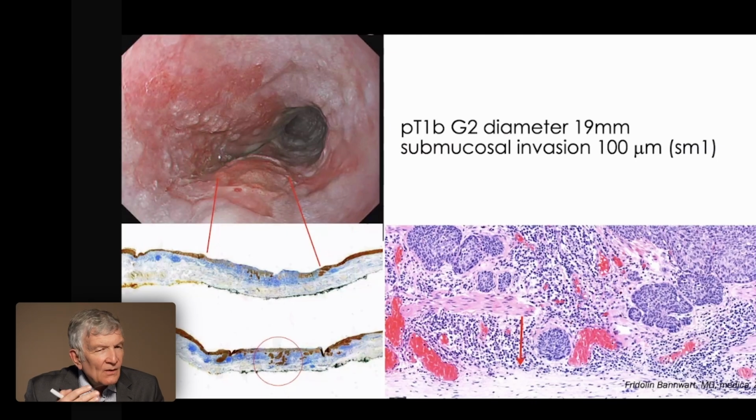Before we were thinking, what are we allowed to do from an oncologic standpoint? So this is over the edge. Now we're trying to get an R0 resection because we are considering, and studies will be done in the future, to have an adjuvant treatment. So not necessarily surgery in high-risk lesions, but defining the risk patient, etc., and try to achieve an organ-preserving treatment.